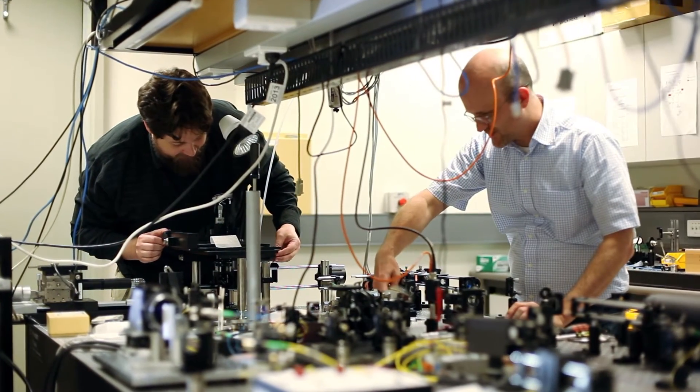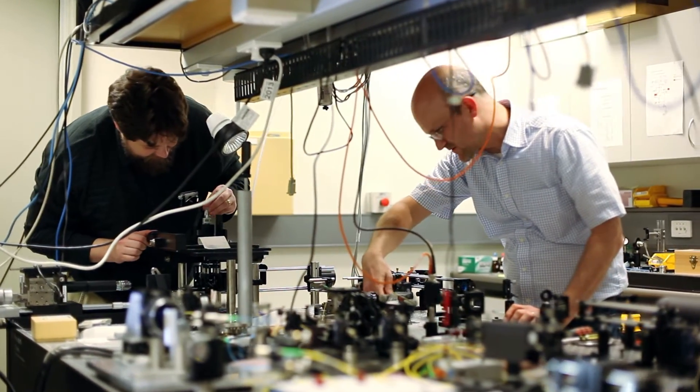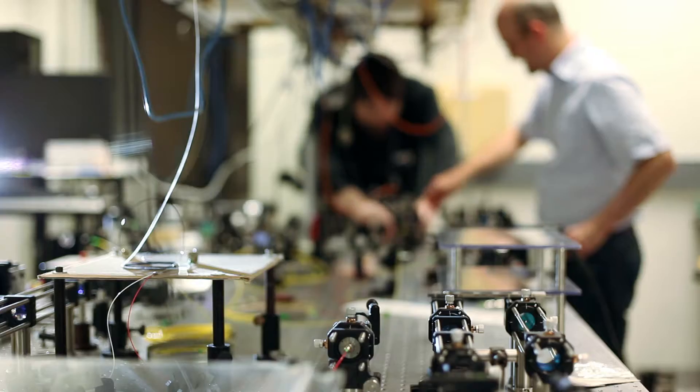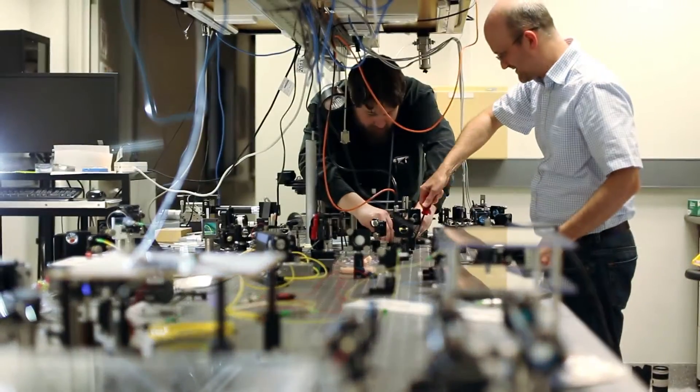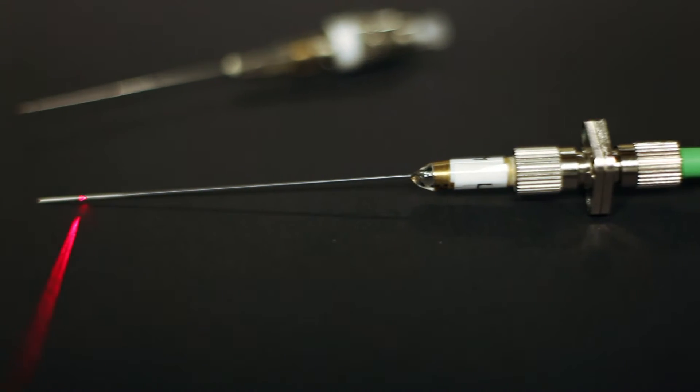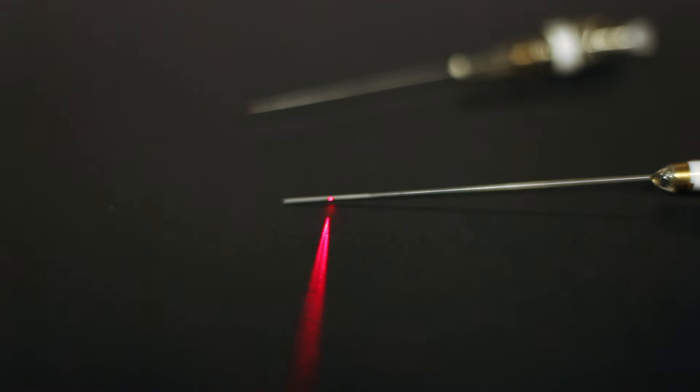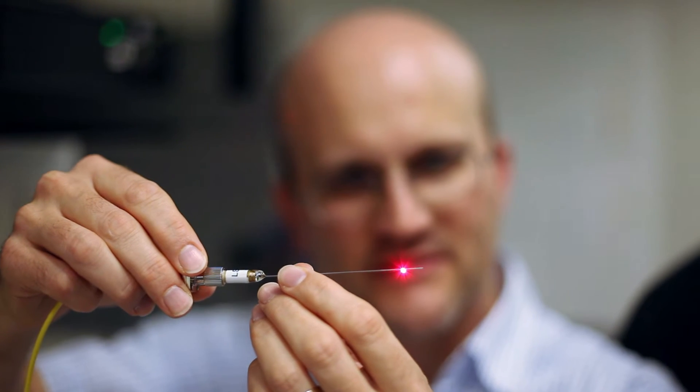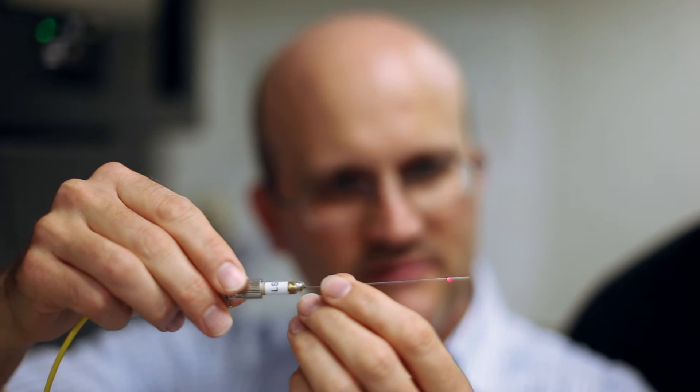The medical industry has long been home to much needed innovations that improve the effectiveness and safety of patient treatment. The University of Western Australia has developed a microscope in a needle that is able to capture images from inside a patient and allows doctors to perform safer and more effective surgery.